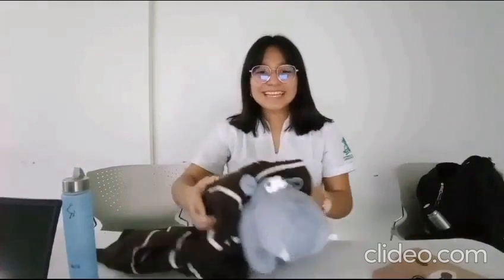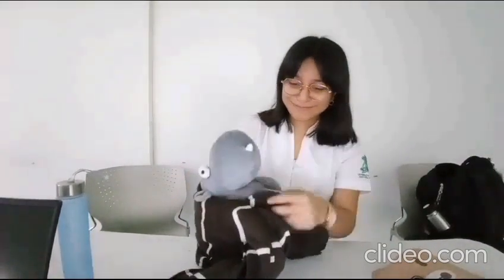For our subcutaneous technique, we will carry out our hand washing. In the same way, explain the procedure to the patient in a respectful way. We place the patient in a supine or seated position according to his physical state and uncover only the region to be punctured. Load your medication and don't forget to change the needle.